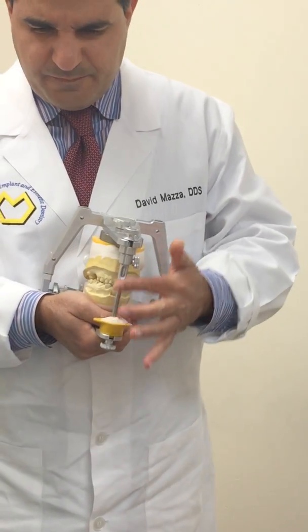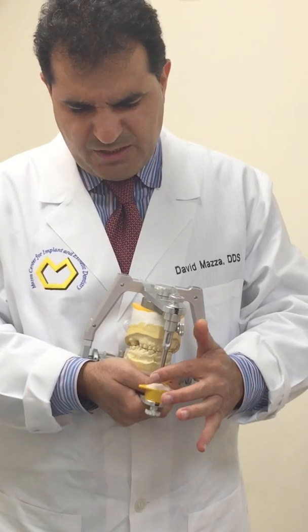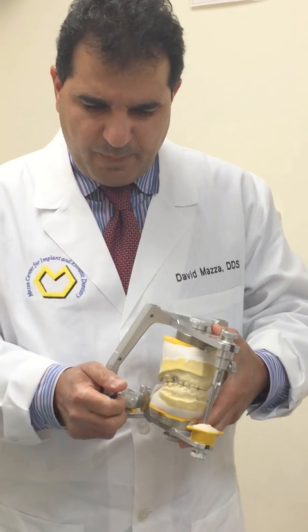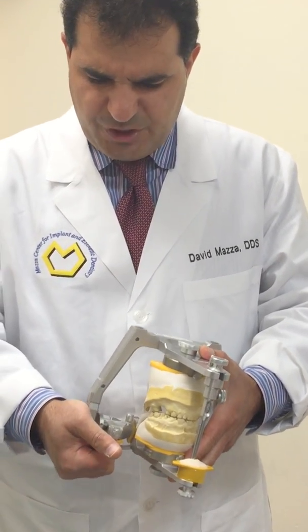I'm going to invert my articulator, making sure my incisal pin — belonging to the incisal guide pin assembly — is going to be touching in the center of the acrylic material.